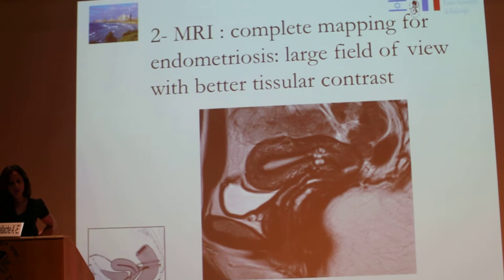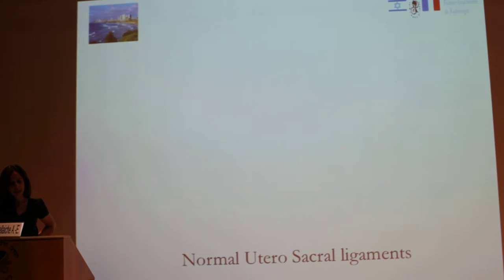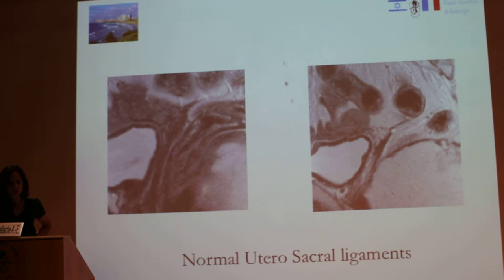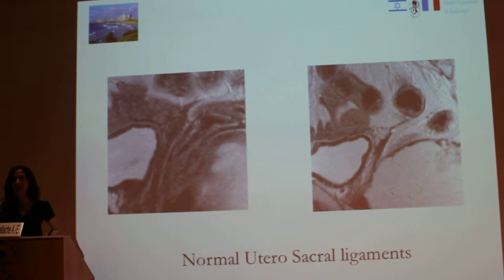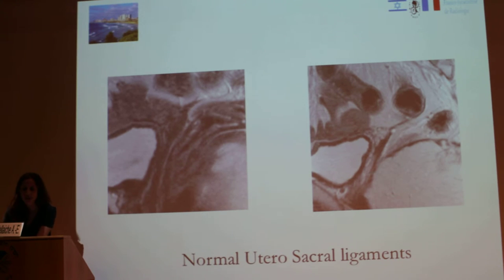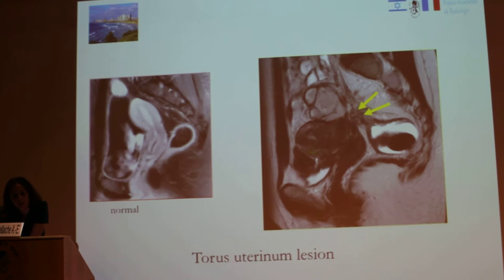MRI can provide complete mapping of endometriosis with a large field of view. For example, here are normal uterosacral ligaments. It is not possible to see the normal uterosacral ligament with ultrasound, but with MRI you can see the normal structure, making it very helpful for diagnosis. Here you have a normal pattern and here you have an involvement of the uterosacral ligament, with uterosacral thickening visible here.